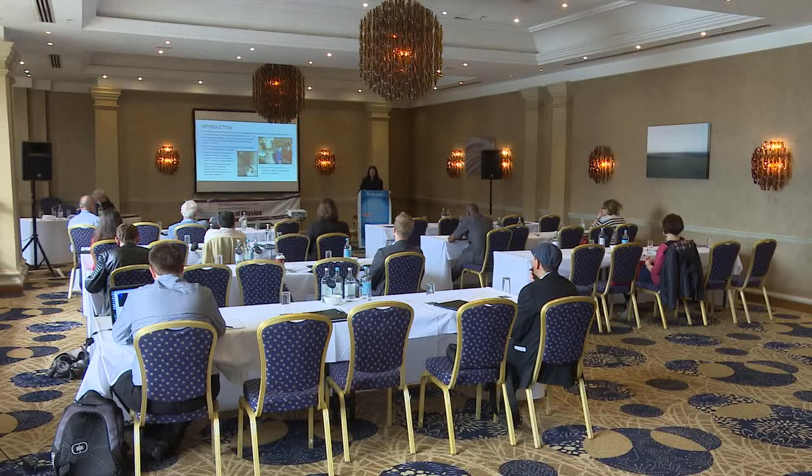The International Commission on Radiological Protection expressed concern about the fact that the use of fluoroscopy outside imaging departments has increased significantly and expanded to the larger clinical areas. And there has been a general neglect and a lack of training, knowledge and awareness regarding radiation protection among those working with fluoroscopy outside imaging departments.